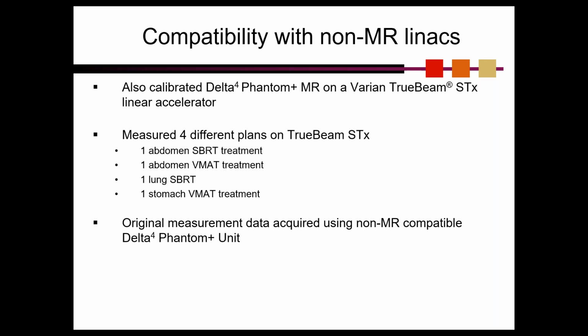The calibration process was performed in an identical fashion to the one that I just described, and the results of these measurements were compared to their original IMRT QA measurements, which were acquired using a different non-MR compatible Delta4 Plus unit.